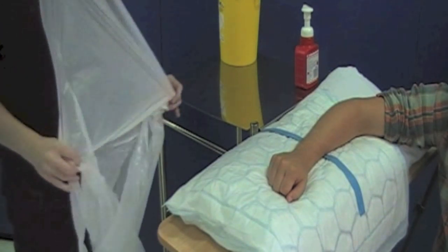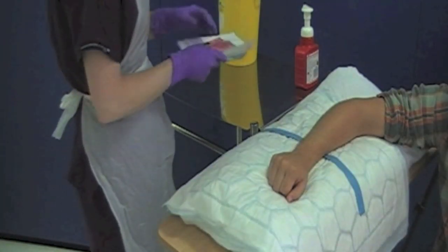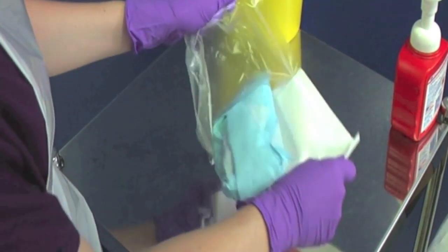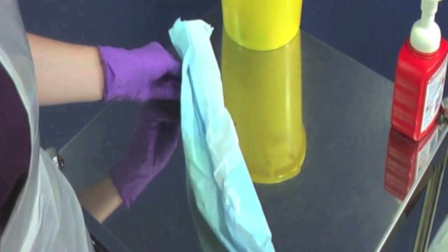Don your apron and gloves. Take the cannula pack from your equipment tray and open it. You must keep the wrapper of the cannula pack as it has the cannula care pathway stickers. Open out the contents of the pack.